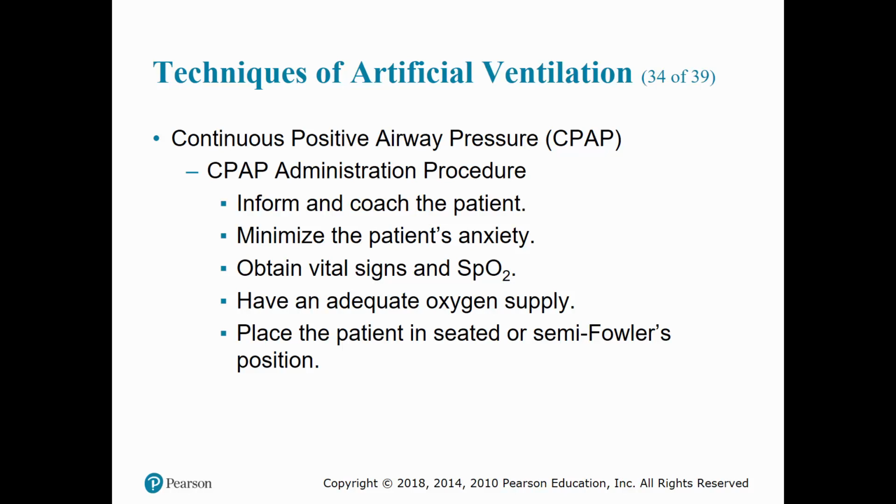When preparing to administer CPAP, you want to make sure that the patient is aware of what's going on and coach them through it. A lot of times when you place a patient on CPAP, they're going to initially feel like they are suffocating or being choked. Ensure that you have an adequate oxygen source, because most CPAP devices use oxygen as their source of pressure. And have the patient in a seated or semi-Fowler's position.